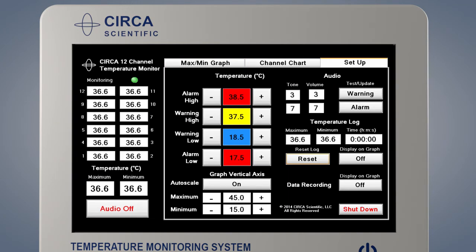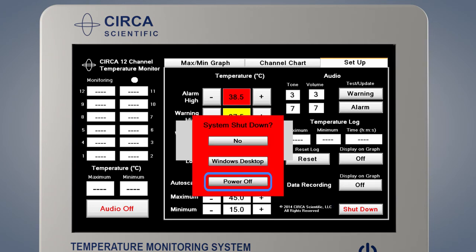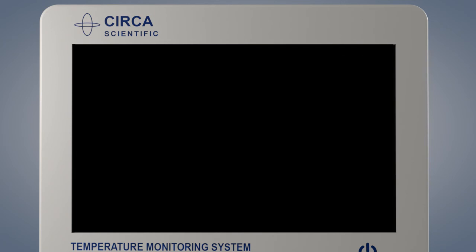At the end of the procedure, disconnect the interconnect cable from the probe and slowly remove the Circa probe. The Circa monitor is now ready to be shut down. Press Shut Down, then press the power off button on the pop-up screen that appears, and the monitor will shut down.